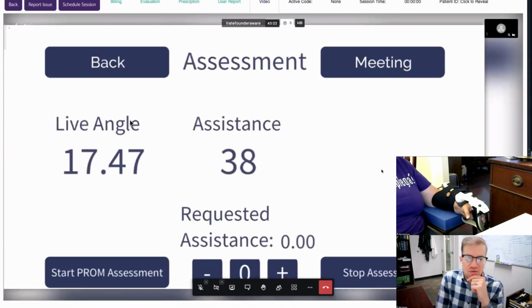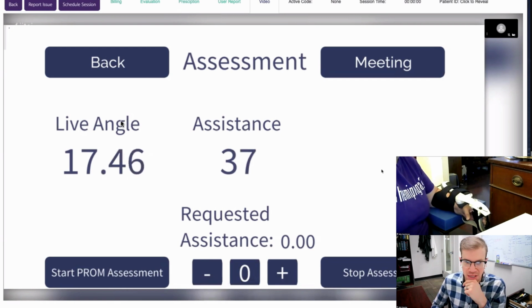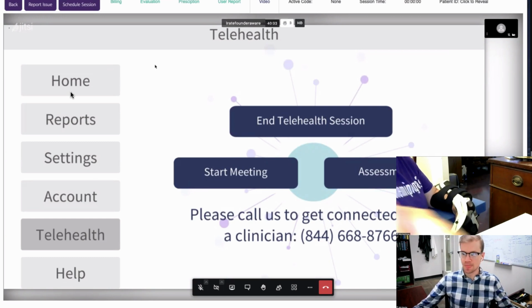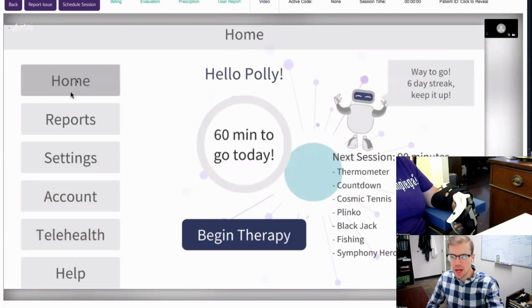So I'm going to have you hit the back button, and then we'll actually go into some of the games, and we're actually going to test this. I want to see exactly where we are in the real gameplay. So go ahead and hit home for me. And then you can go ahead and hit begin therapy.